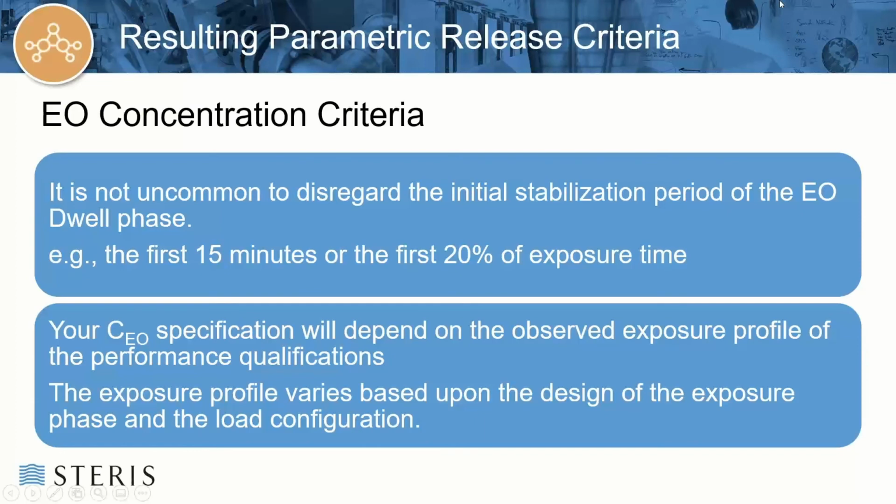Your concentration specification will depend on the observed exposure profile of the PQ qualifications. Your profile varies based on the design of the exposure phase and your load configuration, essentially with minimum loads, variable loads, and maximum loads.